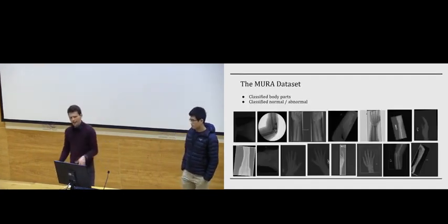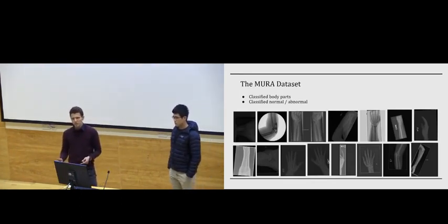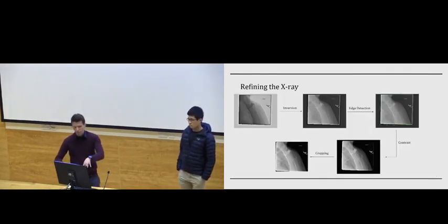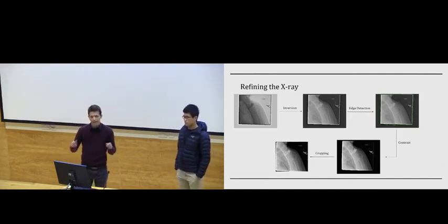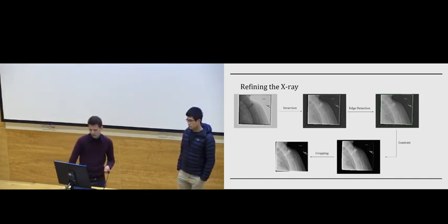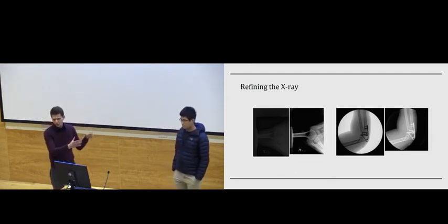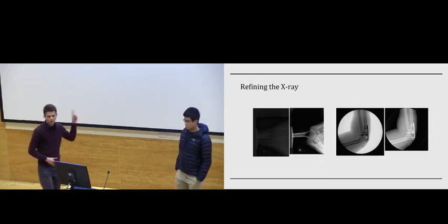The data set that we had has huge diversity. It contains 40,000 images, 14,000 studies, and we try to normalize all of the images into a unified format for the radiologist. So no matter in what format we get the data, we always get something that is clearly visible at the end. For example, these are some examples. In the second picture, we detected that we have to invert the inner part of the circle. In the first example, we managed to turn a black image into a bone.